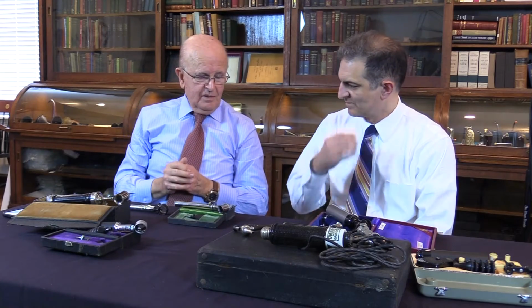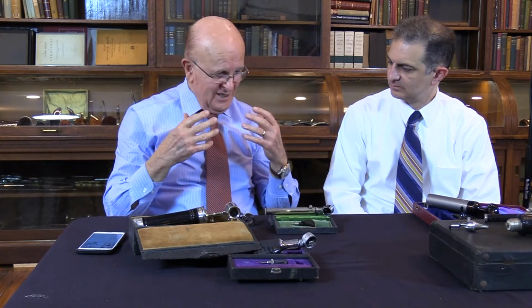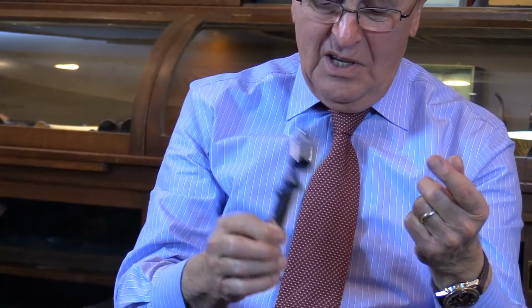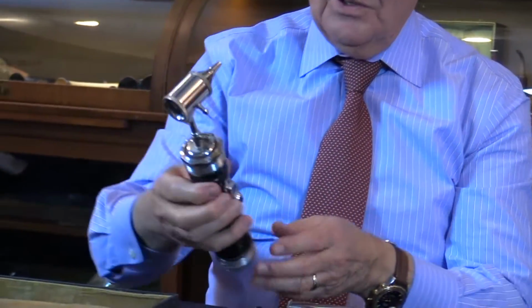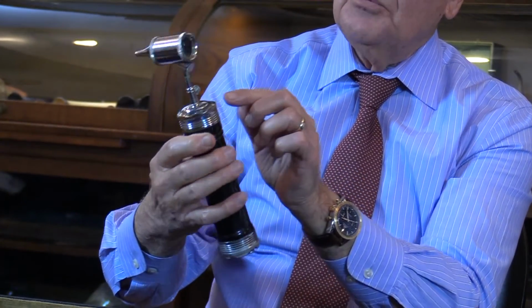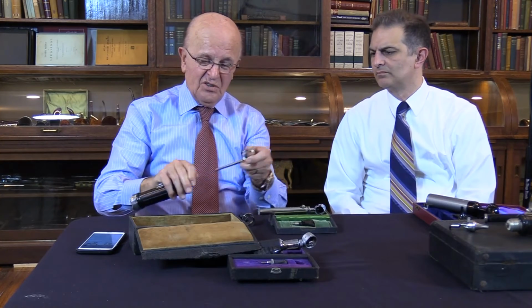So the next thing that inventors worked on is magnification. They wanted to see the eardrum more clearly. They started in the beginning without any lens here. And then this is one of the earliest with a single lens. This is the Burgess otoscope. As you can see, the lens here. But just a side comment, look at the light source, how it is on a different axis from the visual axis. But that, at that stage, was the state of the art.